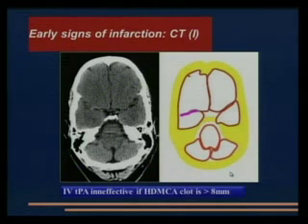Yes, the length. If the length is more than 8 millimeters, this is a big thrombus. So it's more difficult to retrieve with the Mercy or some other method of retrieval. Now, in general, in all places, they are using retrieval, not intra-arterial injection of TPA at the site, because this produces fewer hemorrhages post-retrieval, you know, and it's more effective.